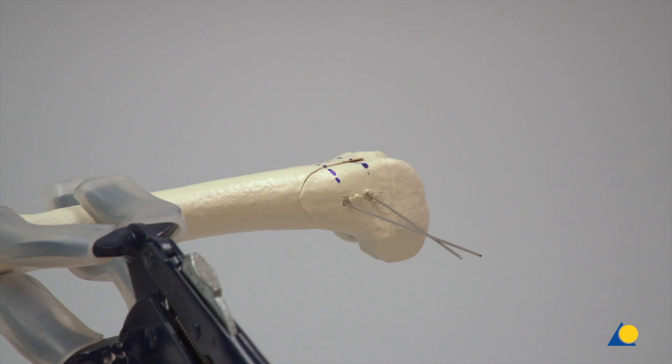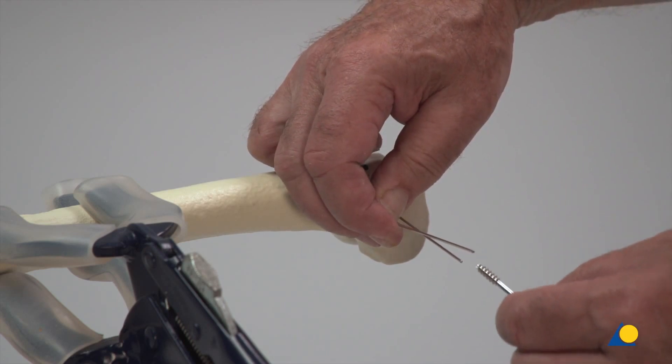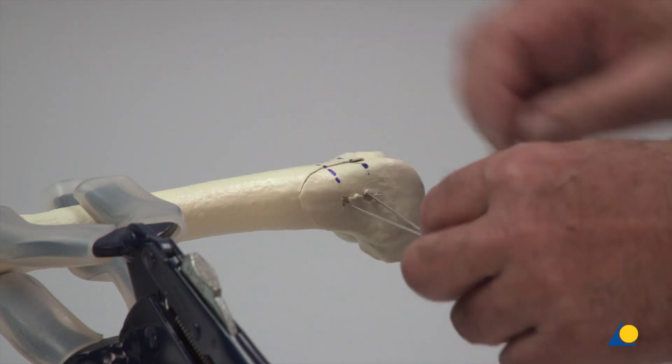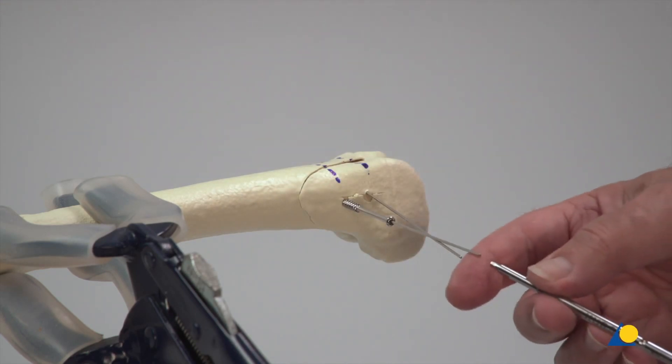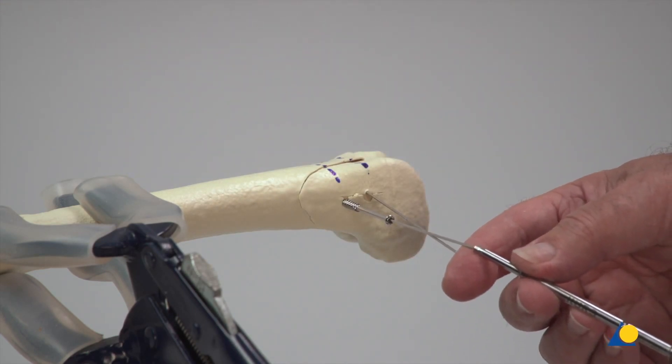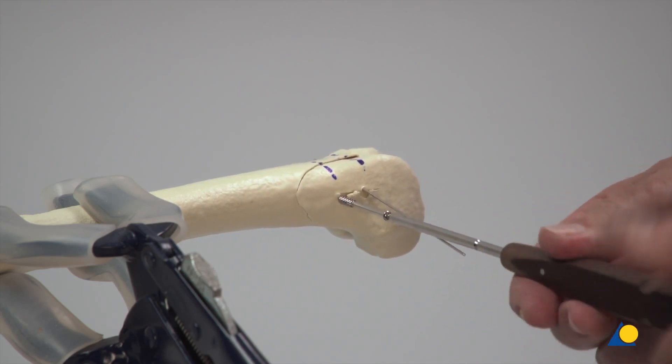After the screw length has been measured, the screw is slid over the guide wire. For ease of insertion, the 4mm self-drilling, self-tapping cannulated screw is passed directly over the guide wire without using the screwdriver. The screwdriver is then passed over the guide wire to advance the screw.